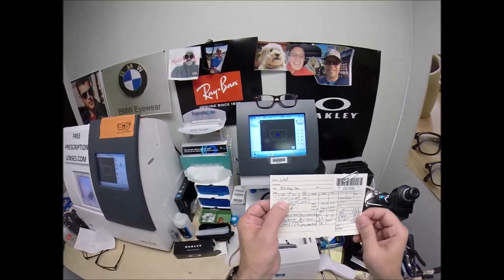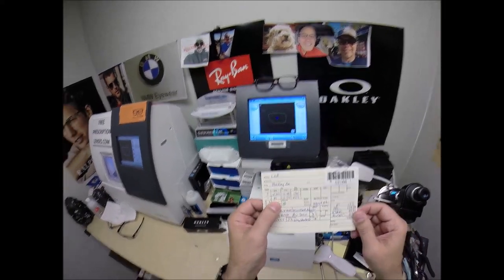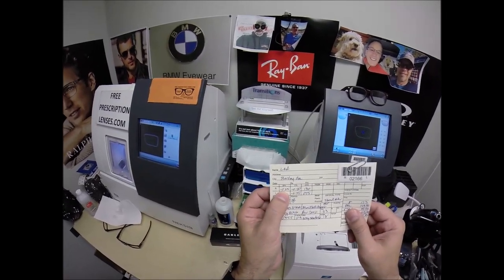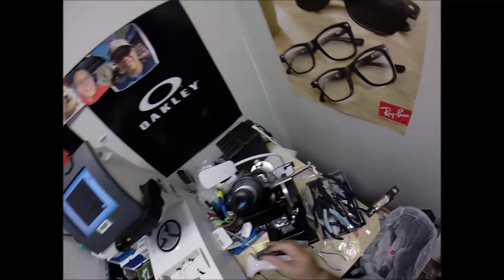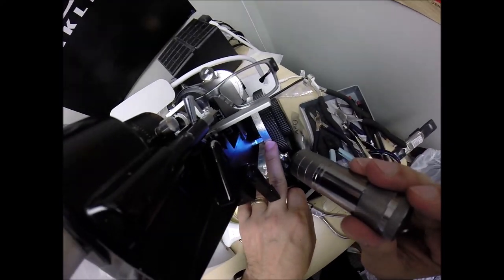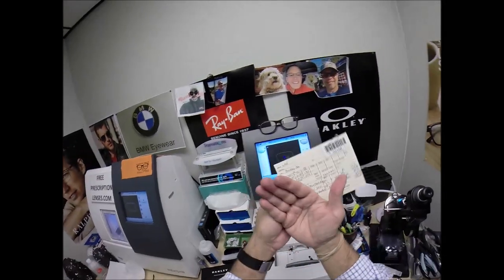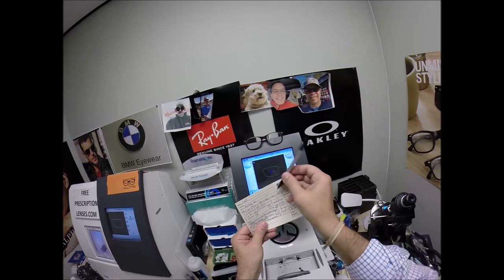That's because remember high school algebra, you add two like signs together. Minus a quarter, minus a 50. Yeah, okay, nobody remembers that. Let's use today's terms. You loan someone 25 cents and then they borrowed another 50 cents after that, they would owe you 75 cents. That's where it has 75 cents in the red. Now this last number where there's two curves lined up could be anywhere from 0 to 180. A straight line is 0 to 90 to 180.